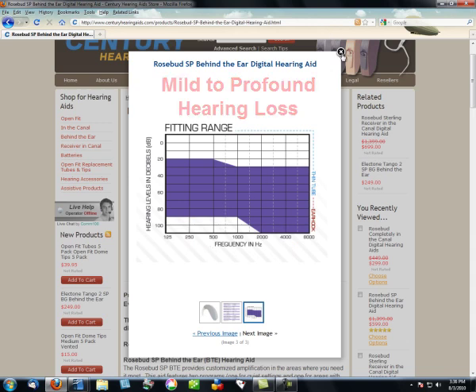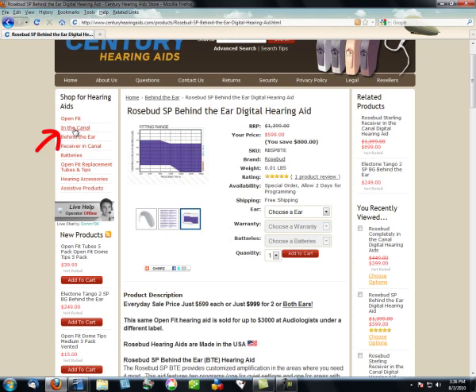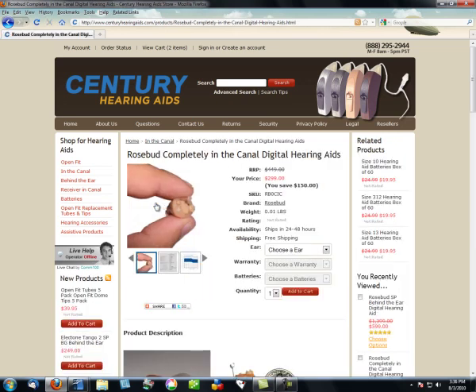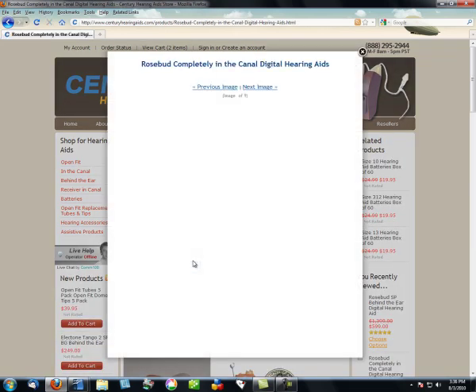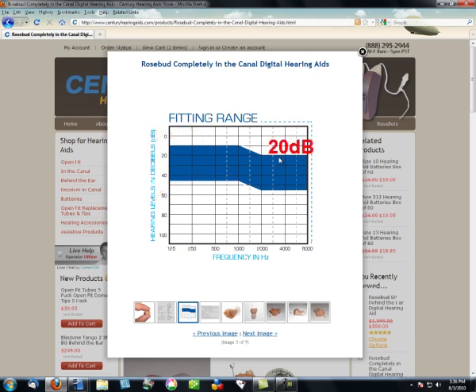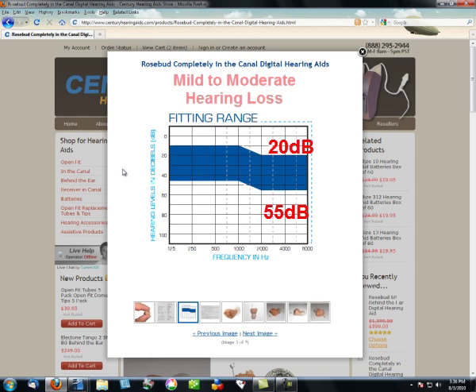Let's take another example. Click on In the Canal Hearing Aids and select the first one, which is the Rosebud Completely in the Canal. Open it up and go to the fitting range chart. You can see this goes from 0 to about 45, and in the higher frequencies it goes from 20 to about 55. This instrument or hearing aid is designed for individuals with mild to moderate hearing loss.